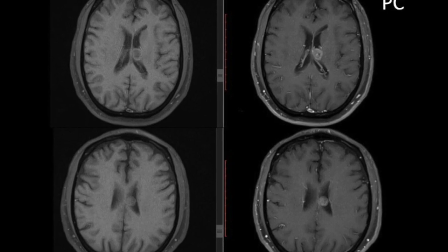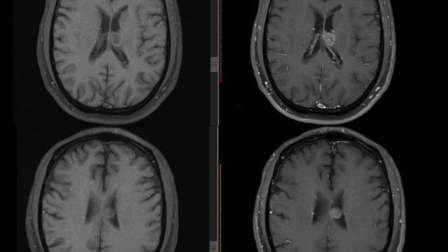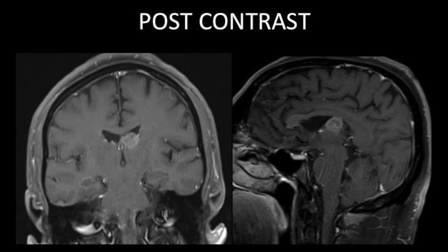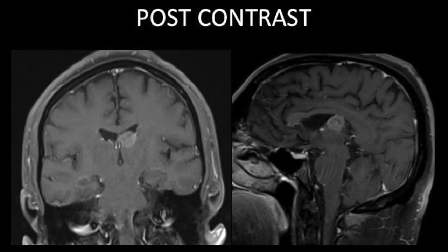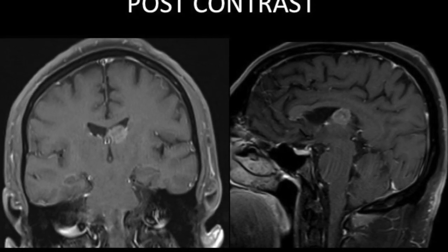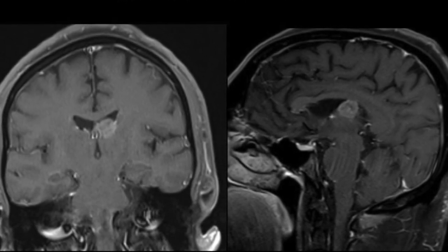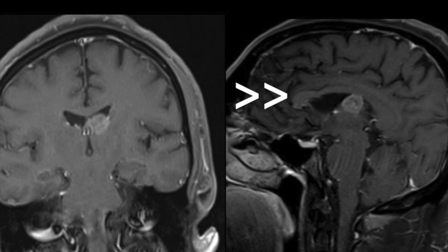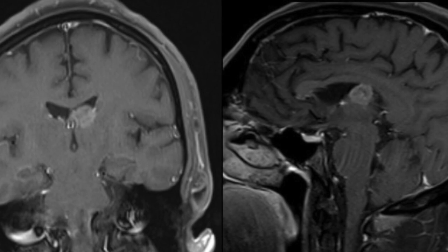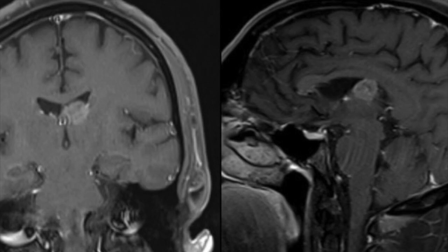The post-contrast images show intense heterogeneous enhancement within the lesion. Post-contrast coronal and sagittal images confirm the intensely enhancing intraventricular lesion. There was no dilatation of the ventricular system and no intraventricular hemorrhage. There were no other enhancing lesions within the rest of the brain parenchyma, and no lesions within the skull vault. In a known case of carcinoma lung, this is suggestive of choroid plexus metastasis.